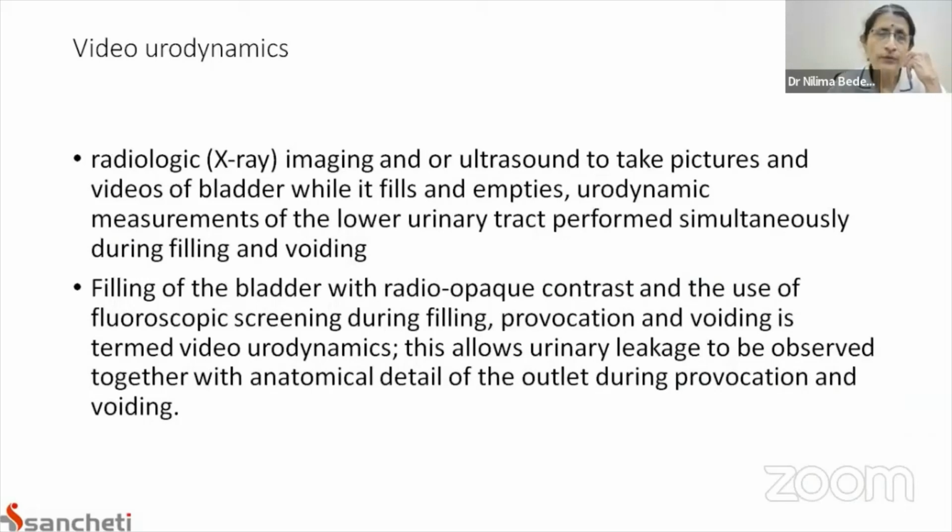Next comes video urodynamics, which is done on very rare occasions, but it uses radiologic imaging or even ultrasound pictures. Instead of water, a special fluid that is captured by radio-opaque contrast is used, and all this testing is done very dynamically to see what is happening inside the bladder as well as during the leakage.